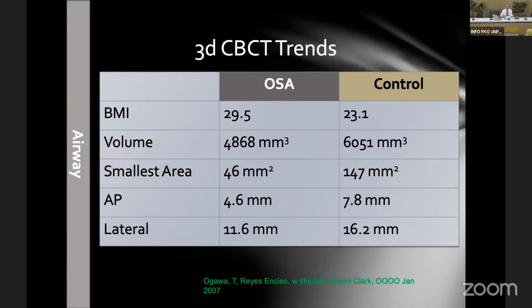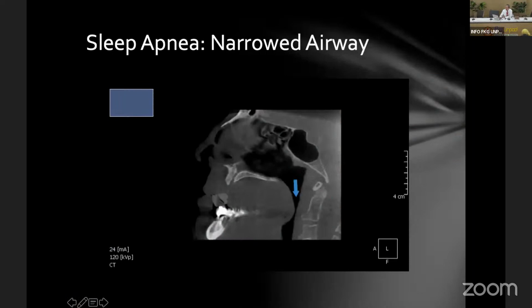But with cone beam CT, we cannot provide a definite diagnosis for obstructive sleep apnea. The reason is that when we take cone beam, the patient is standing or sitting, not really in a sleep condition. So we still rely on the medical diagnosis. But some of the dimensions can help us assess where the narrowing of the airway is, and that's the difference between normal and sleep apnea.